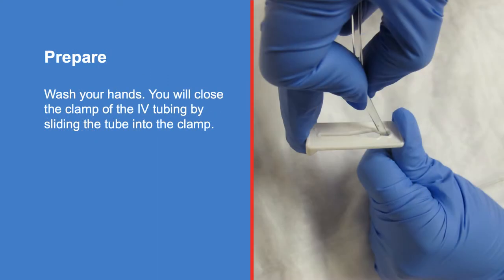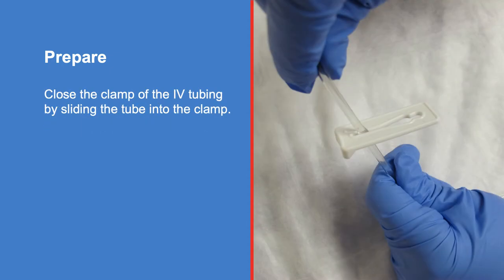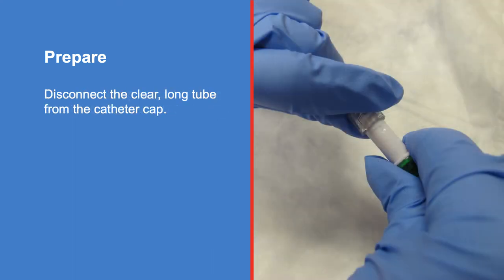Wash your hands with soap and water and put on both pairs of gloves, one on top of the other. Then you will close the clamp of the IV tubing by sliding the tube into the clamp.